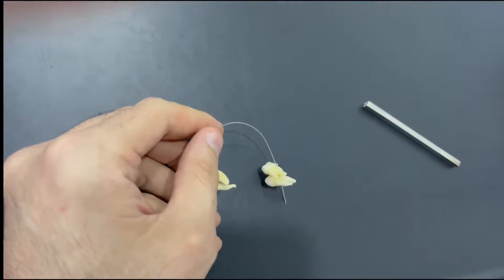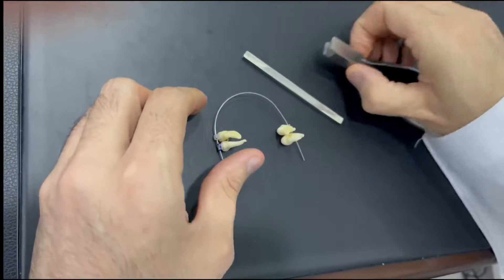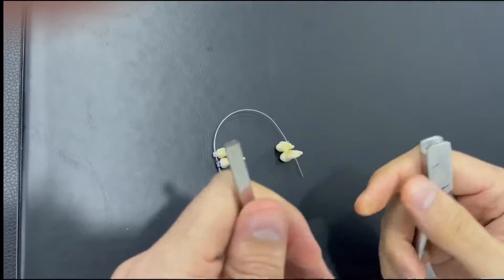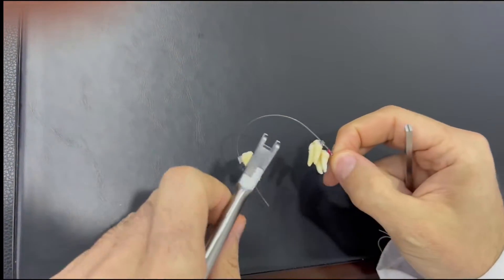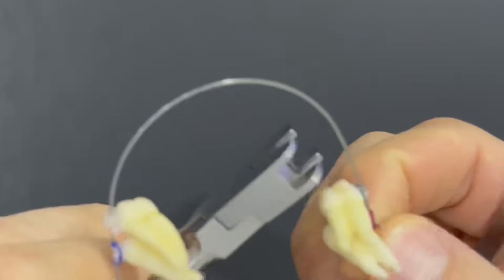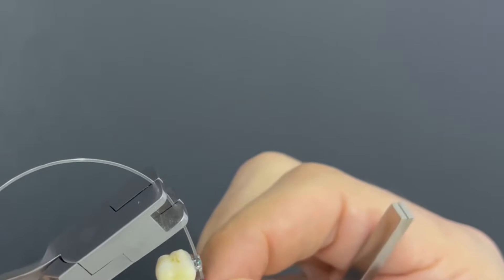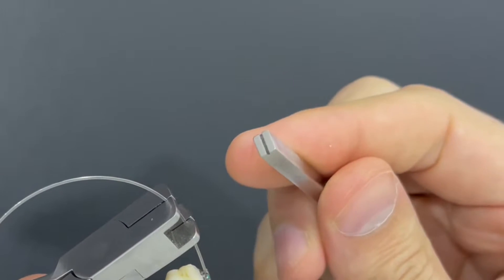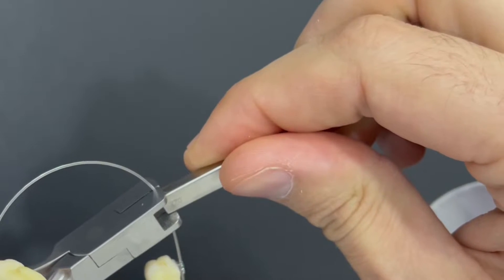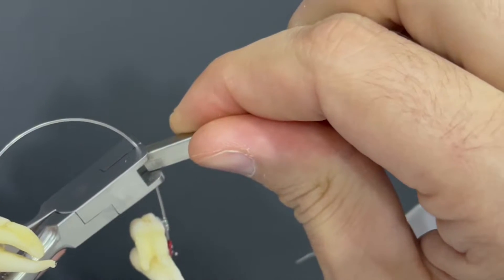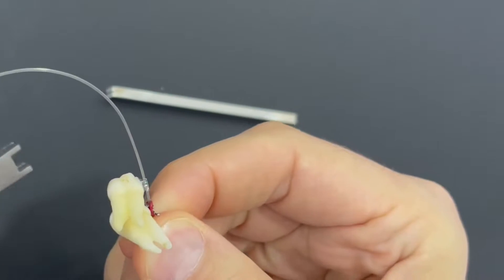I'm going to show you how we can change the torque of a single tooth using these two instruments with a rectangular stainless steel wire, locating the desired position and changing the torque.